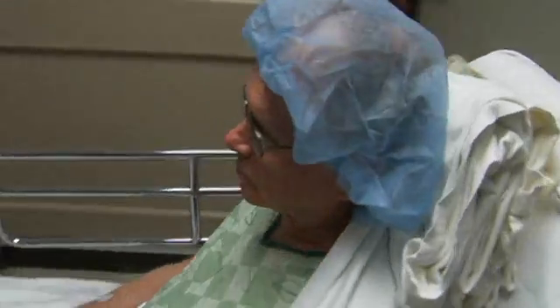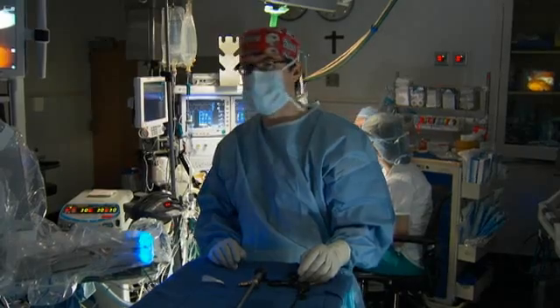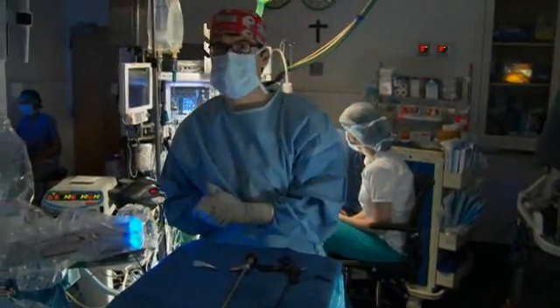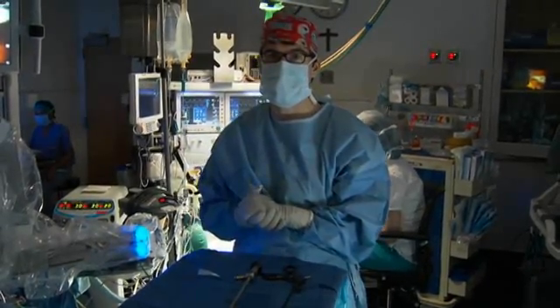The doctor wants to come and talk to you as soon as he's all finished. The robot's been docked, all of our ports have been placed, and all the robotic instruments are in place. This is the patient side part of the robotic arm, which basically does the labor for me. I control the robotic arms from the console over here. So we're going to get started, prepare his kidney, and then we'll take a good look at the fluorescence imaging later.